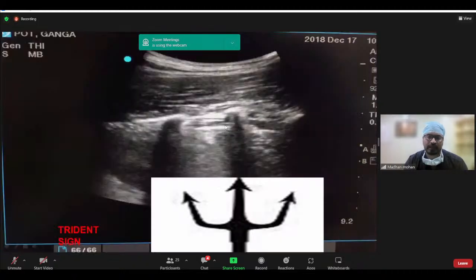If you move further lateral, you are going to encounter the transverse processes. The transverse process will be a square type hyperechoic line and acoustic shadow underneath that. Okay, so the transverse process is not letting the echoes go beyond them, so you are getting an acoustic shadow underneath that. And in between the transverse processes, you can see the soft tissue window.